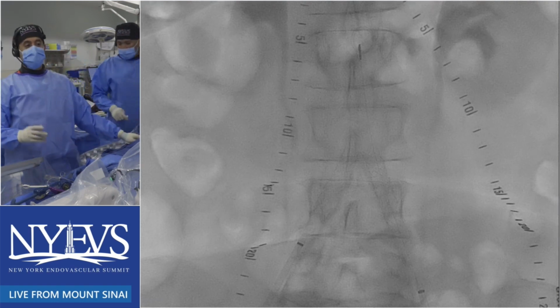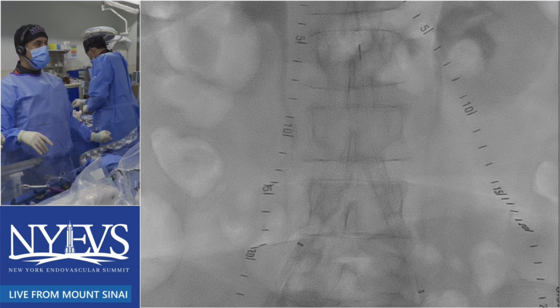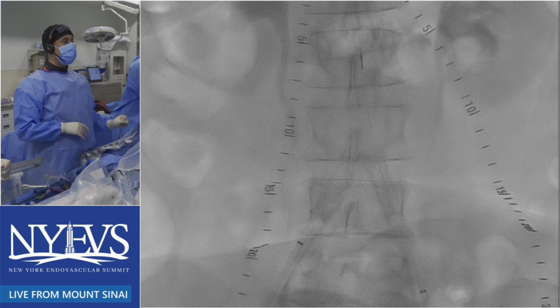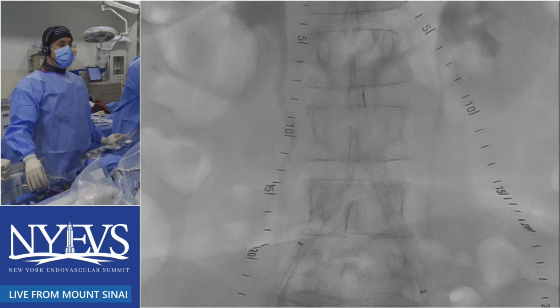But I actually, give me the one, give me another one. The angiogram that they had at the end was really a good example of, they actually dilated that distal aorta some. And I usually do that as a pretty extended inflation. Like I'll leave them up for 3 to 5 minutes. I don't just put them up for 30 seconds and take them down.